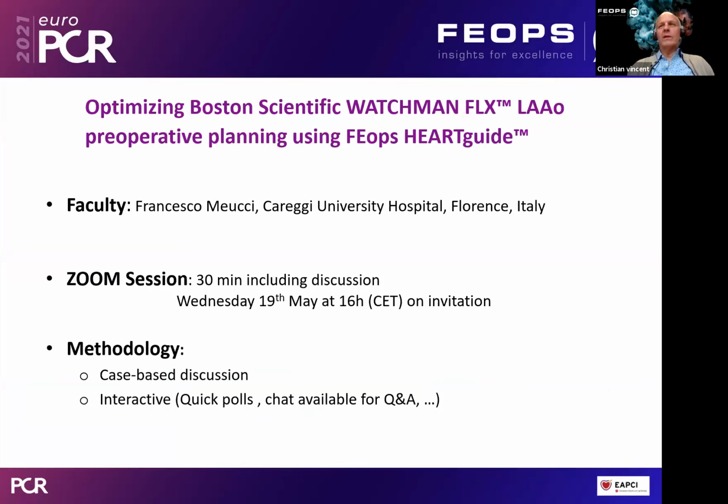As you know, we are FEops, and FEops is really engaged this year in EuroPCR 2021. We have an education village, and today we will have a very interesting session on how to optimize the Watchman Flex in LAA preoperative planning using FEops HEARTguide.